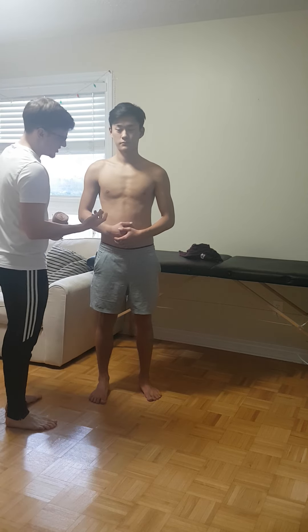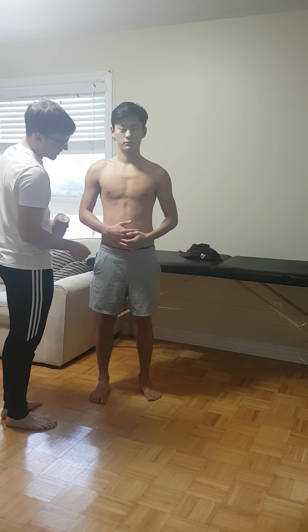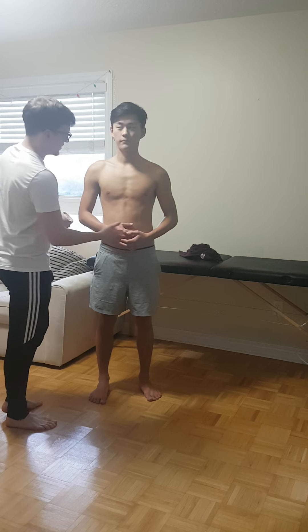I'm just going to check PMS real quick — checking cap refill, which is good. Can you just wiggle your fingers for me? Good. You can feel this? Yeah. Okay.